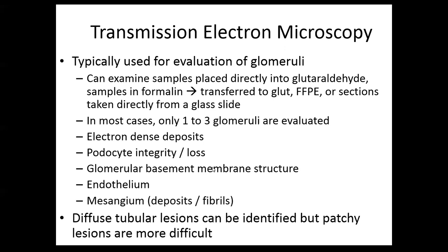Okay, but if we're looking at glomeruli, what are we going to do? These are some of the things that I do like to emphasize to pathologists so that you can talk to your clinicians and guide them appropriately. So what happens is normally, wait, I think this is a typo here. So place directly into, yes. So please, I'll remove this when I send this presentation out.